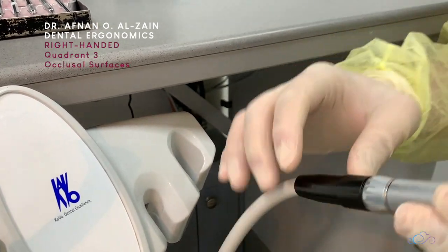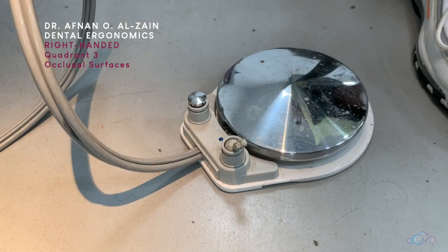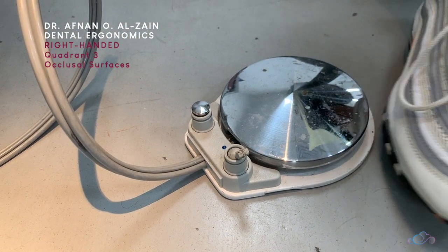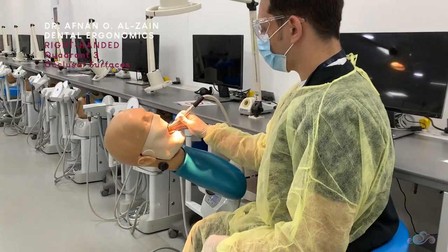After placing the burr, make sure that it is stable and that the handpiece is secure. Then make sure that the water is turned on in the foot control. Make sure that your neck is at a reading distance from the occlusal plane.